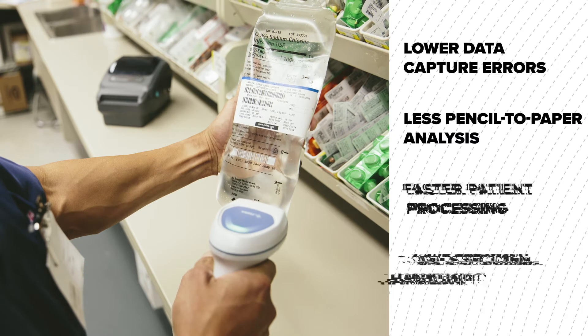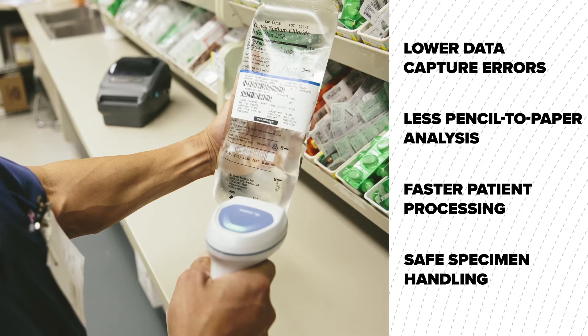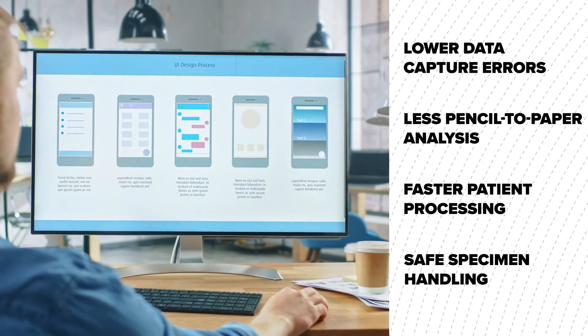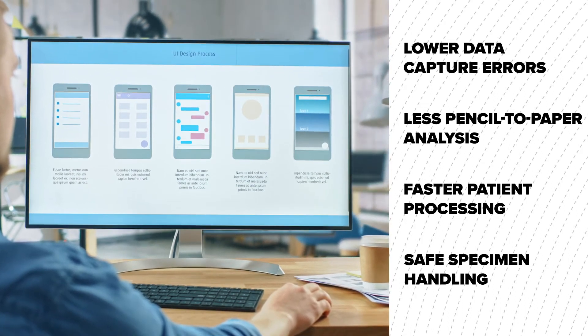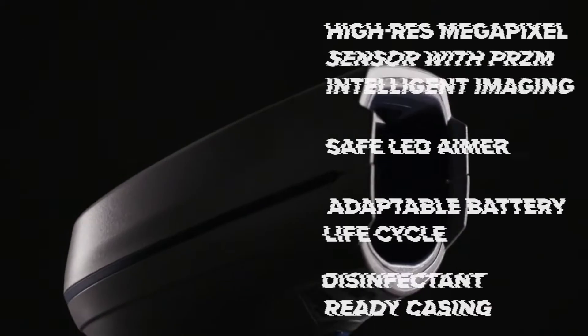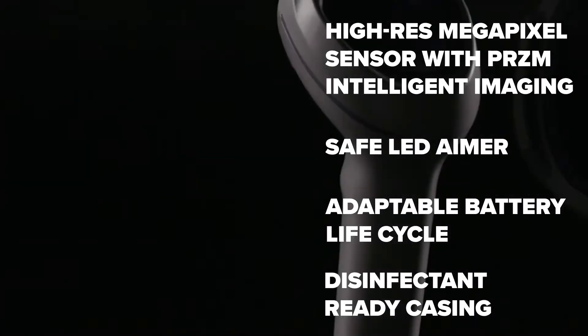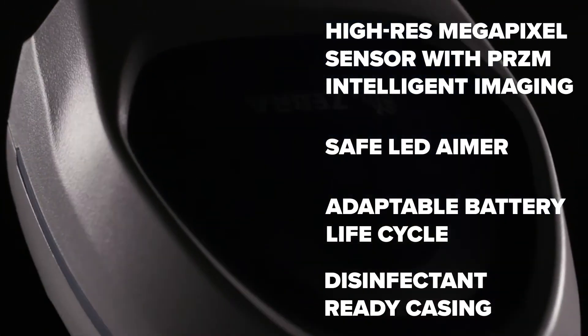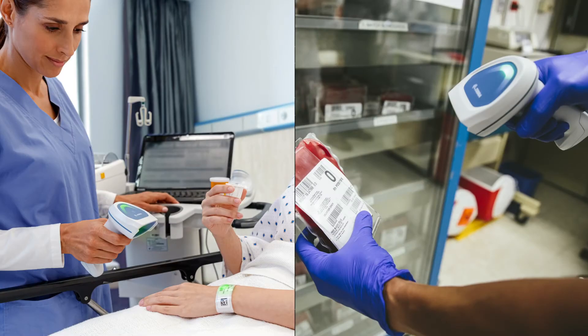Crafted for higher accuracy rates, Barcode Inc's specimen collection system mitigates errors with intuitive custom software design, staging and configuration deployment, reliable mobile device management and true support, all while equipping your staff with Zebra's best-in-class healthcare-grade scanner, so you can preserve specimen collection efficiency from start to finish.